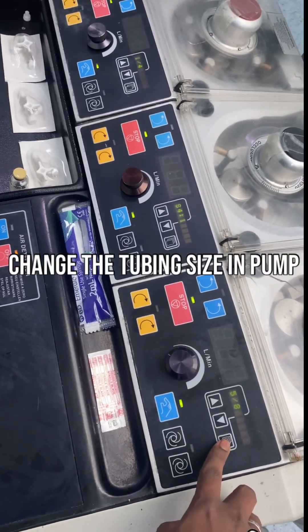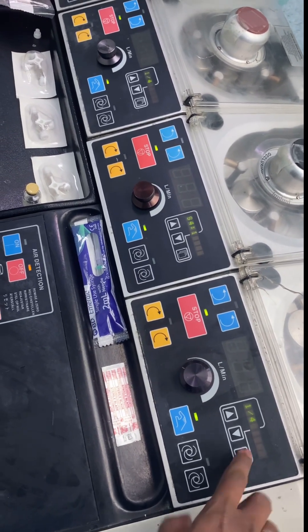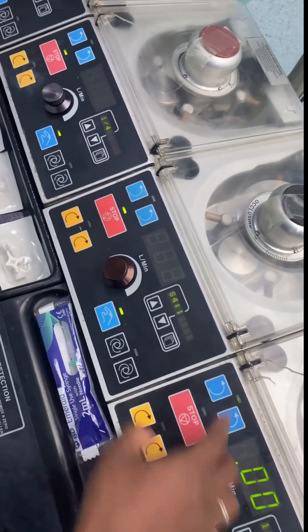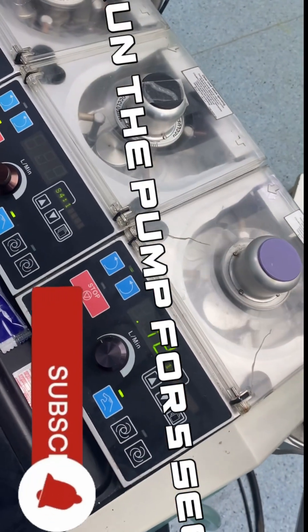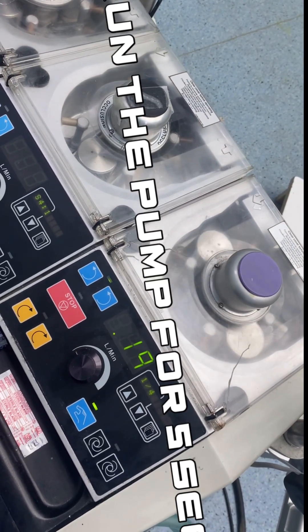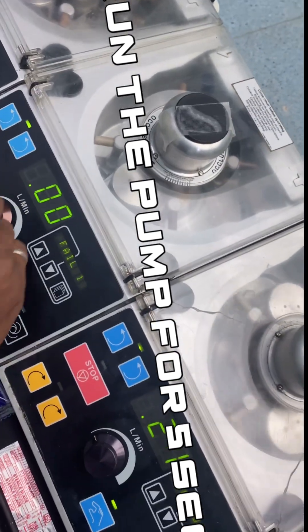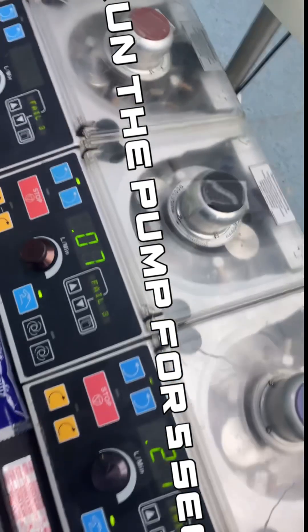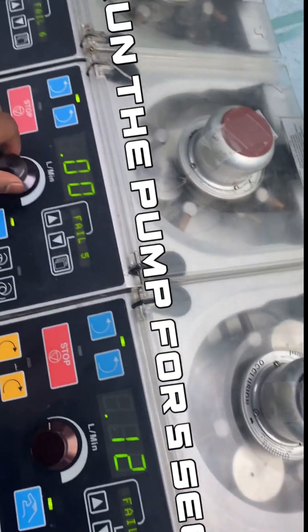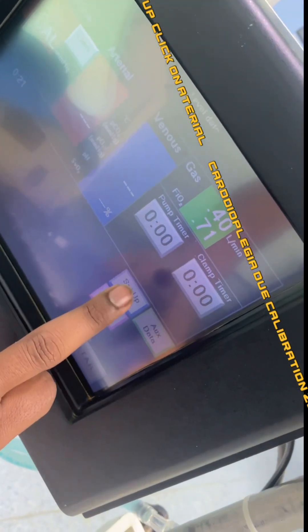Change the tubing size on the pump. Run the pump for five seconds. Go to Setup, click on Arterial and Cardioplegia, and do Calibration 0.